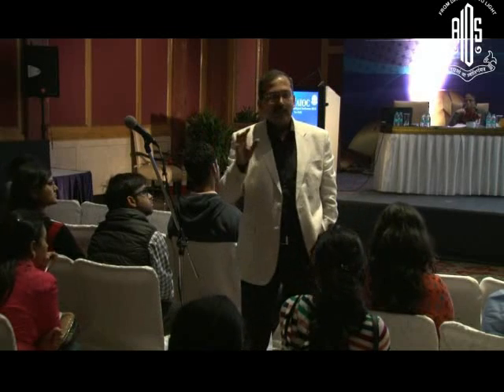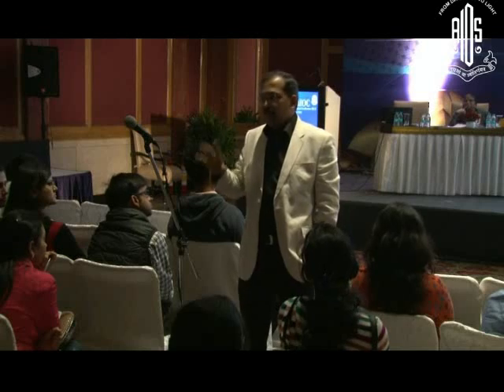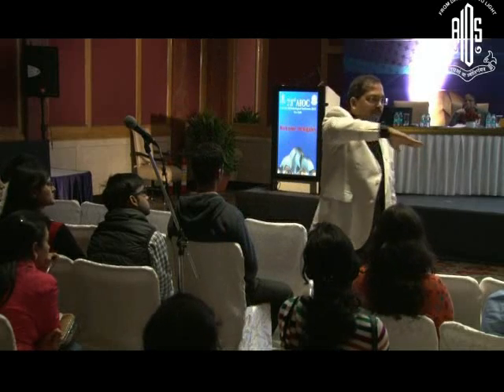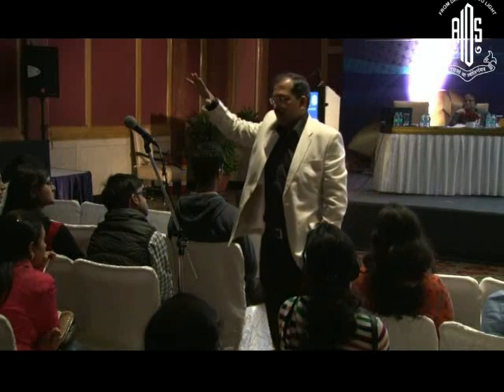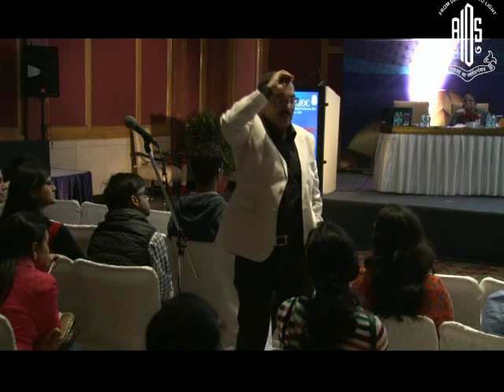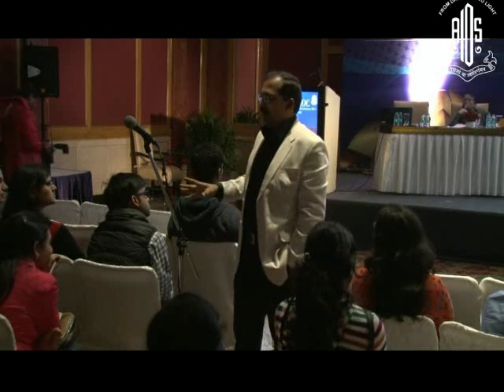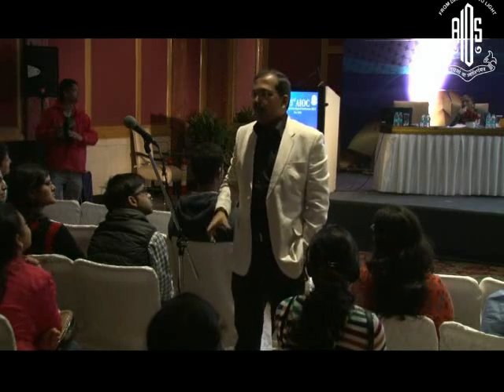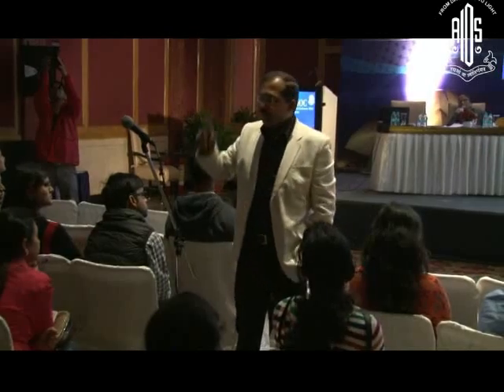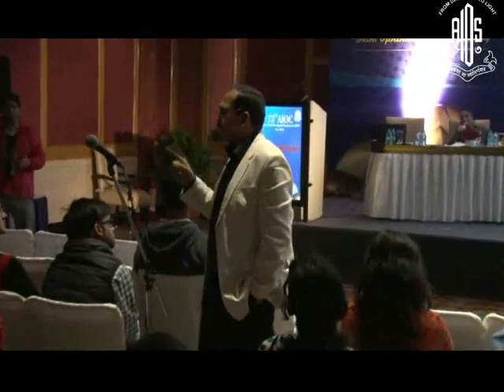Number one is, first see the amount of refractive error. See, the cornea is 500 microns. We are going to take a 130 micron flap. So 500 minus 130 is 370. See, some mathematics is required to earn money. You should remember this much arithmetic. I want to keep 300 microns of cornea intact. My residual stromal thickness should be 300. So 370 minus 300 is 70.